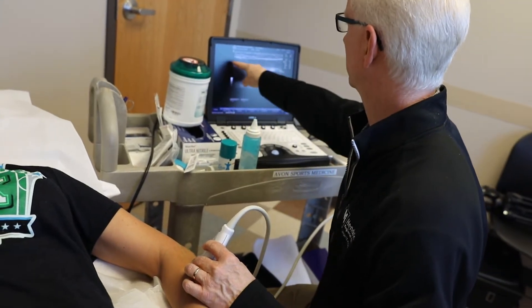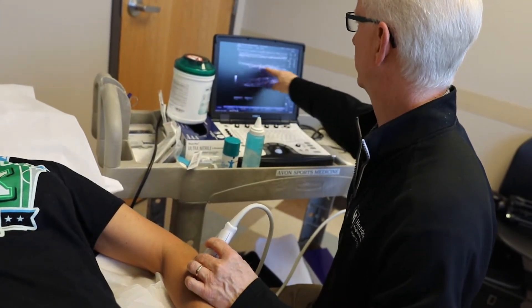It's relatively new in the United States. I've been doing it for a decade and it's becoming more and more popular because it's less expensive than an MRI, and when it can be used for certain purposes it can be just as good or a substitute for MRI.